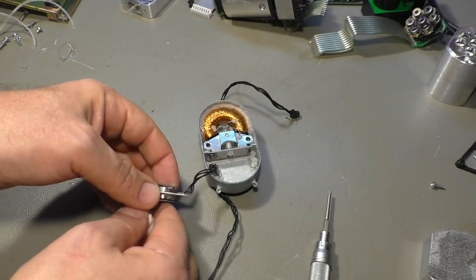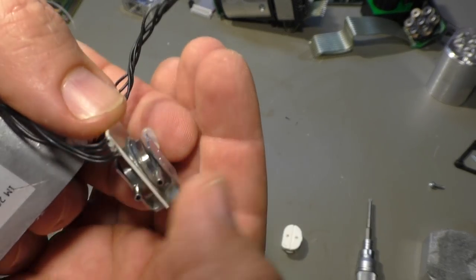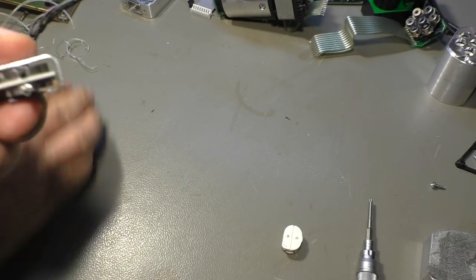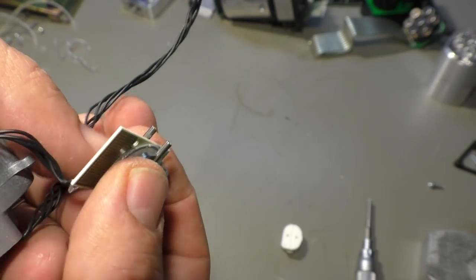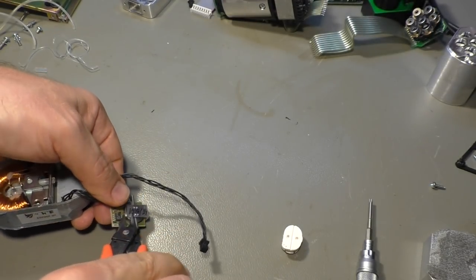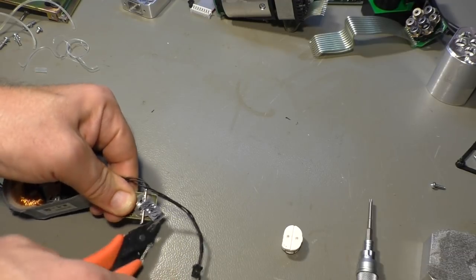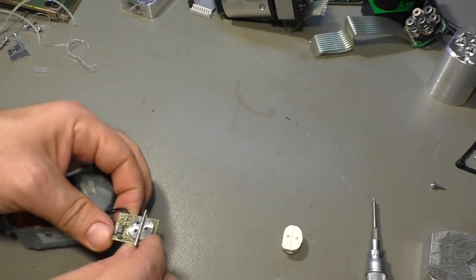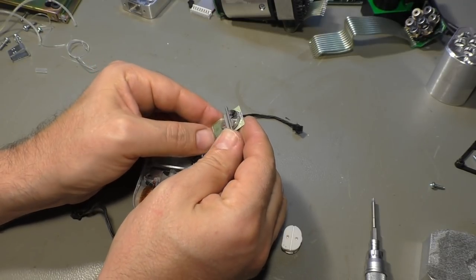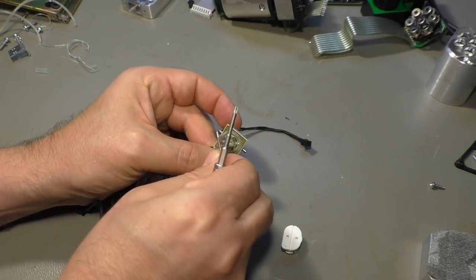Those holes connect to the ports here. And that's some kind of differential pressure sensor for high speed changes. So, or in other words, it's some kind of a differential pressure microphone. Can we open that? Well, it has a clamp here. Yes, it moves. Okay. So, what's that? It's all well glued together. Okay, something popped off.